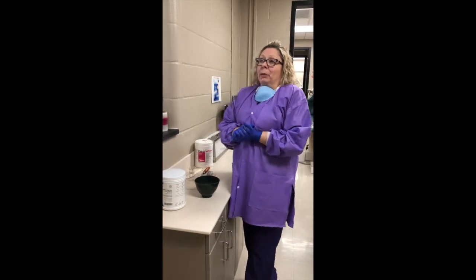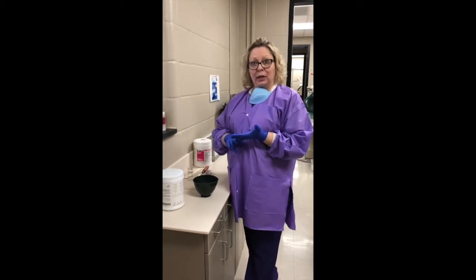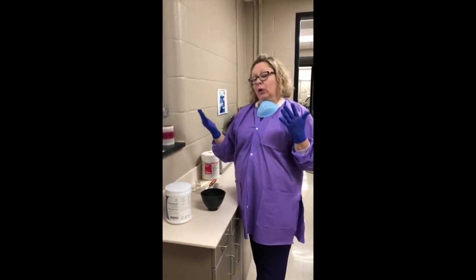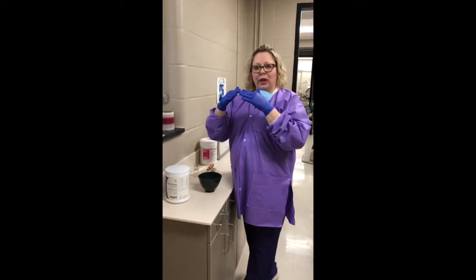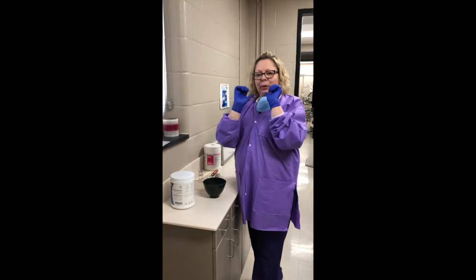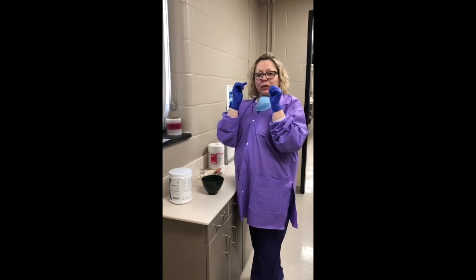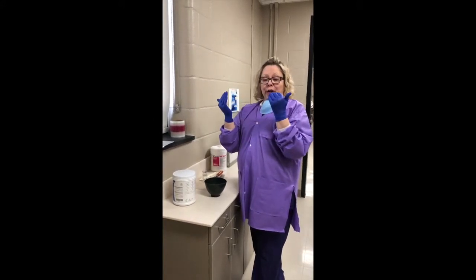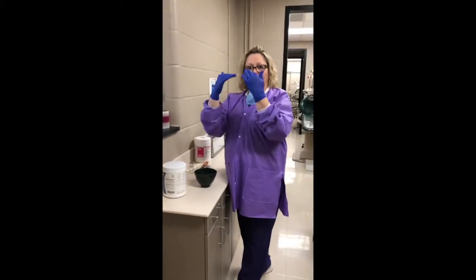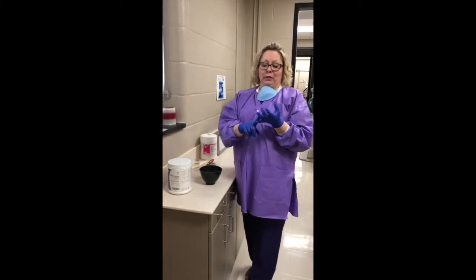The couple of objectives we're looking for towards the end of this lesson is, one, we want our students to learn how to pick the proper size tray for their patients, because not all arches are created equal. A bigger person may have a bigger mouth, therefore a bigger arch, and so they need a tray that's wider. The tray has to cover the arch so that all the teeth are enclosed inside of it when you seat it up in there, and it goes around a couple of millimeters above the maxillary dentition or the mandibular. When you seat a lower tray, the tongue tends to be in the way, so your patient has to lift their tongue and lay it down over the top of the tray in order for that lower tray to correctly get all the dentition. So that's the first objective, pick the right size tray.